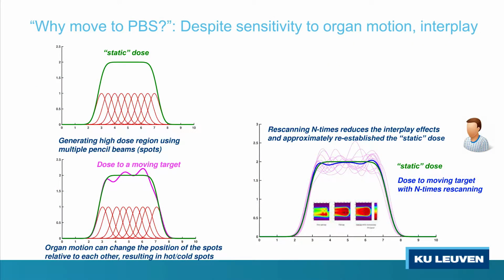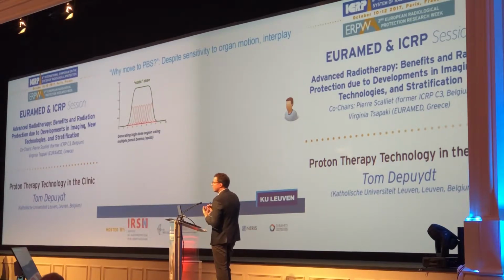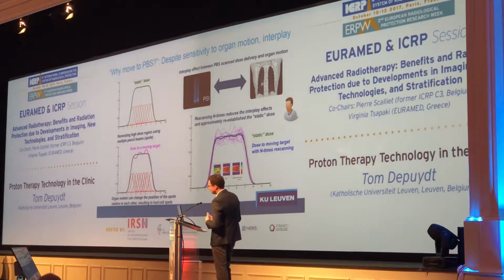The interplay effect is an important one. So the interplay between the delivery, which is actually a time-resolved process. So you see here that a dose is actually made out of all these small deliveries, and they have to be aligned correctly, because otherwise you will not get the dose distribution that you intend. If you have motion, then it seems the movies are not working. But anyway, you have the delivery process, there it is. And you have the tumor motion, so the interplay effect between them will make these different spots not aligned with each other, and they create a different dose distribution summed up than you intended. So there are techniques to overcome that in PBS, for example rescanning, so that means actually delivering the dose in smaller parts repeatedly.